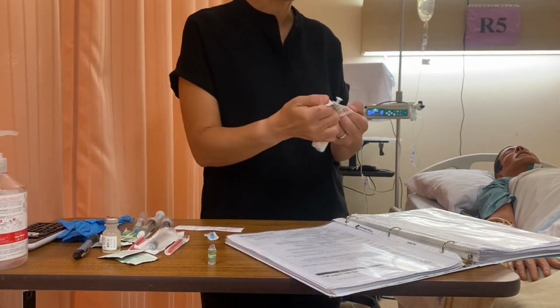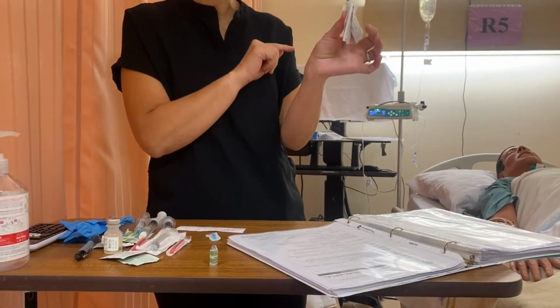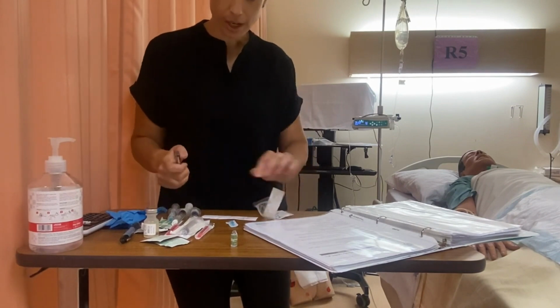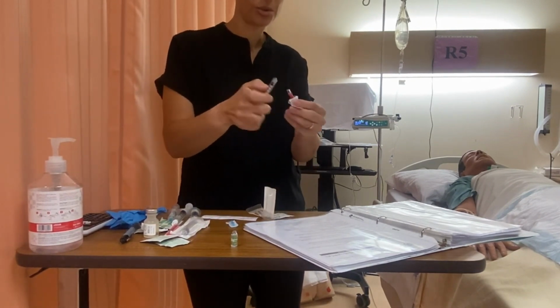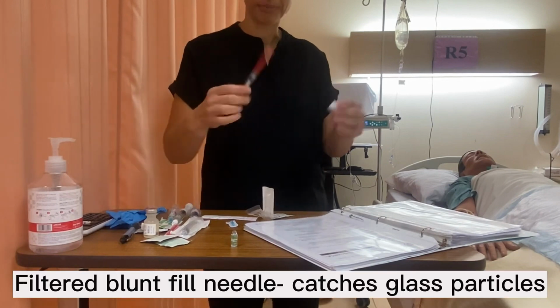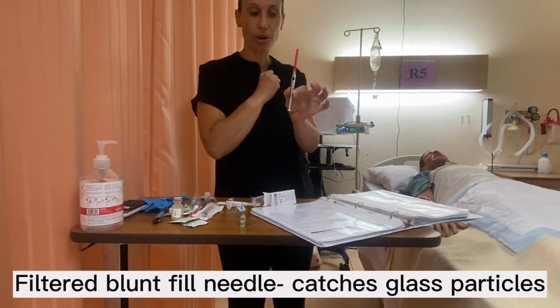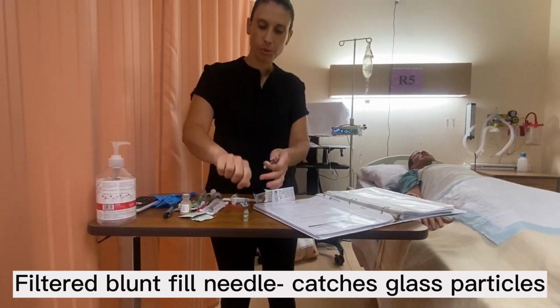So I'm going to peel open my 1 mL syringe, and this is an appropriate size syringe because it'll give me very accurate titrations. Okay. Now, because this is an ampule, a glass ampule, we're going to use a filtered blunt fill needle. So this is one that's got a filter inside, so it's going to filter any glass particles that might be inside the morphine. So we've cracked that open.